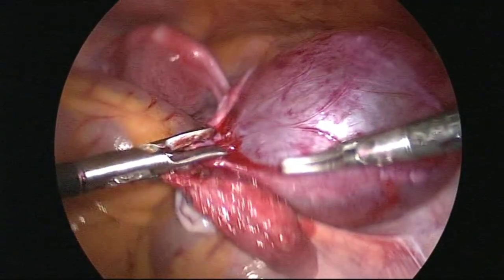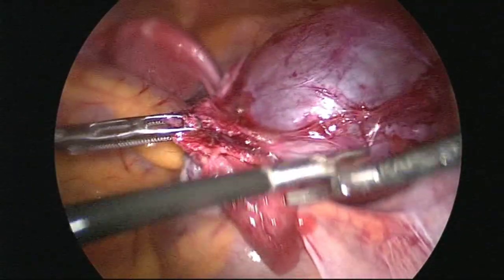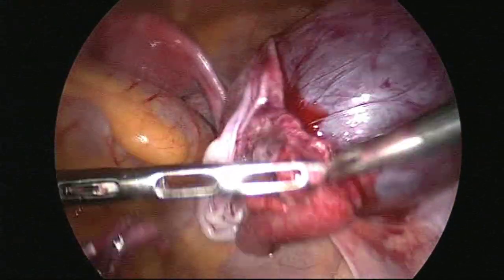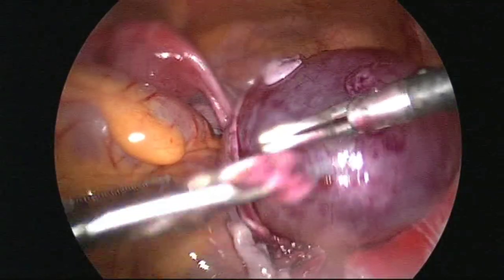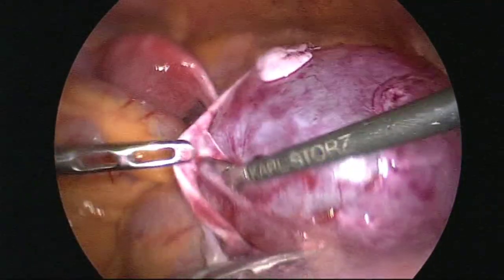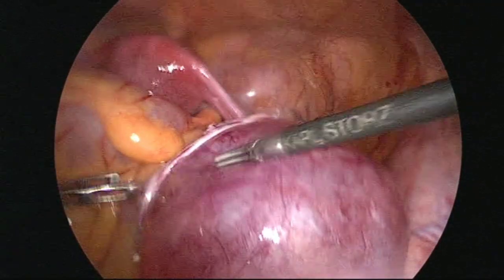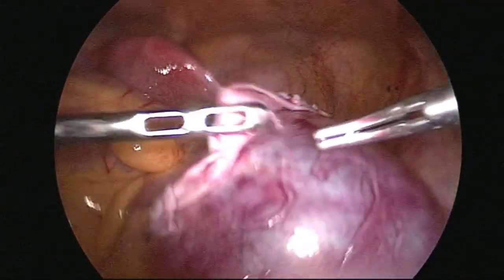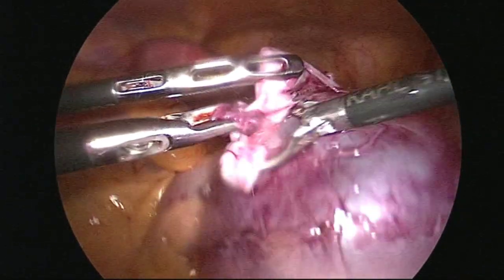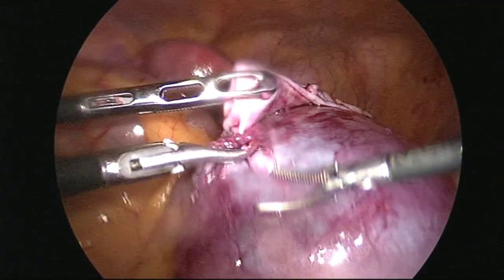A little loosening is there. I have to control. These are the feeding vessels. Few more fibers.